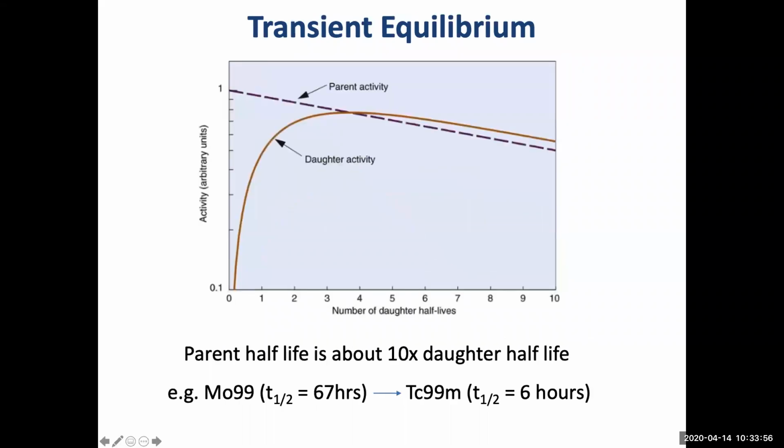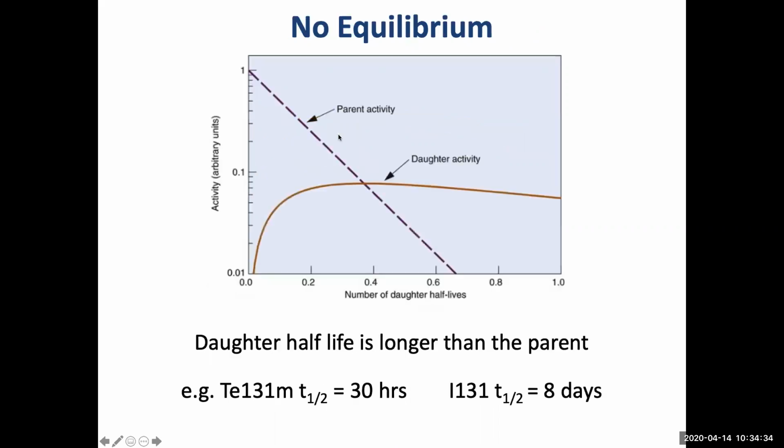In nuclear medicine, we are talking about transient equilibrium between the molybdenum and technetium. This is important to understand because when you use the generator, you need to understand this kind of equilibrium. When to elute your generator? We have a generator in nuclear medicine to get technetium. So shall I elute it now? Elute means to get technetium from the generator, and we're going to explain that. Every how many hours can I elute the generator? Usually when we get the maximum activity, when the daughter reaches the parent here. So this is the maximum activity we can extract from the generator. We'll go through this one now.